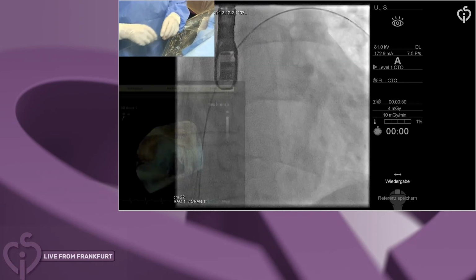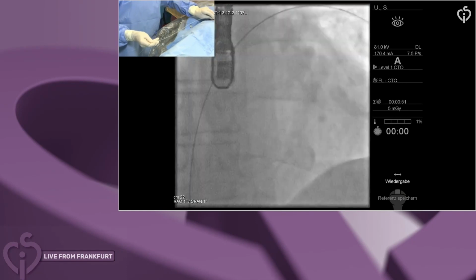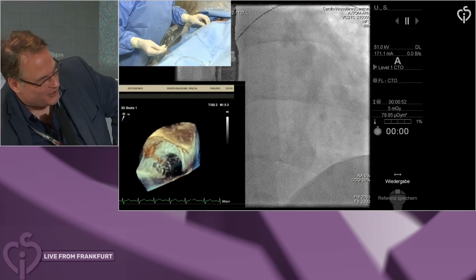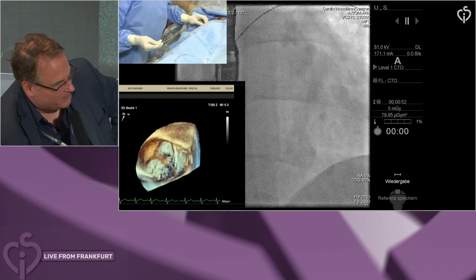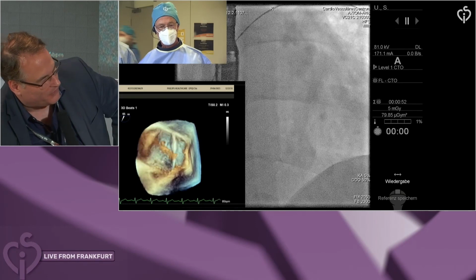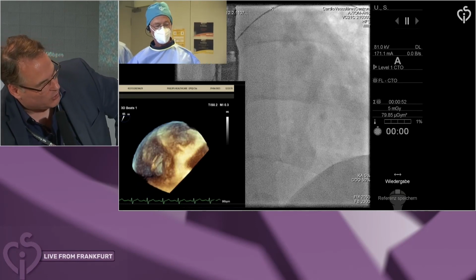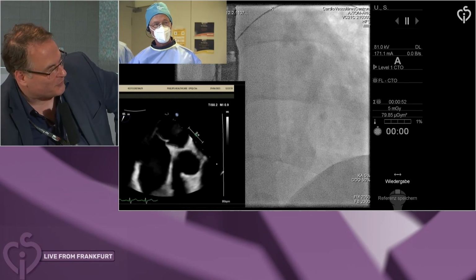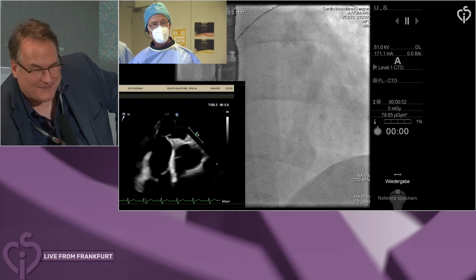Now we can do the measurement again with the Stefan von Bardeleben technique with the stiff wire. But we see distinctly different anatomic situations here compared to the first case. We have a much nicer rim. We have less excursion so far with the catheter, and I guess also with the wire, and we have a smaller base. So I hope you also consider PFO occluders now, instead of going with an ASD occluder in this case.